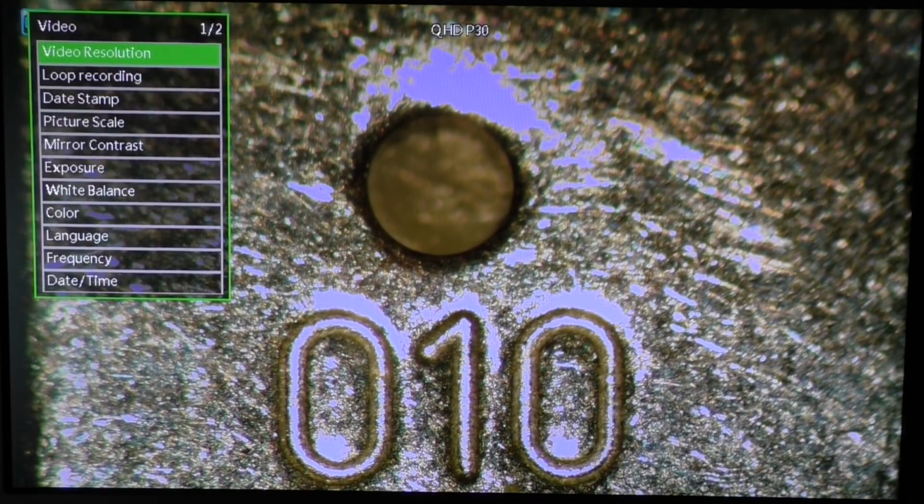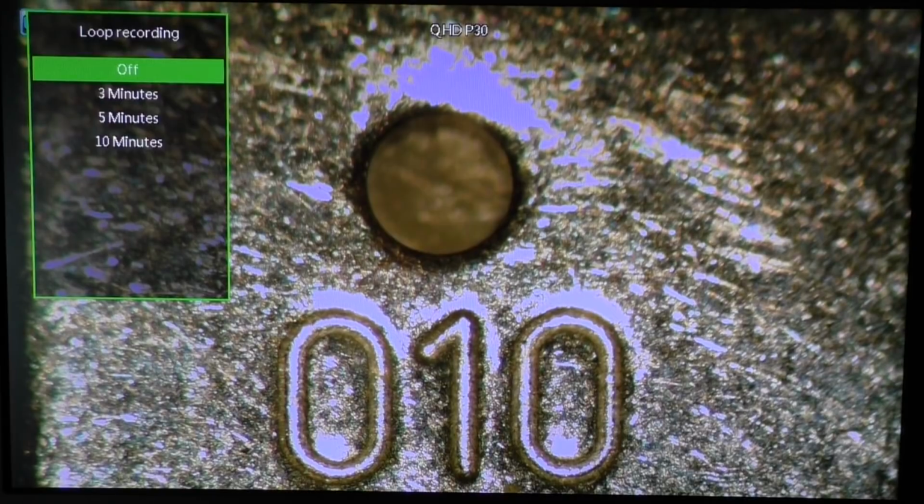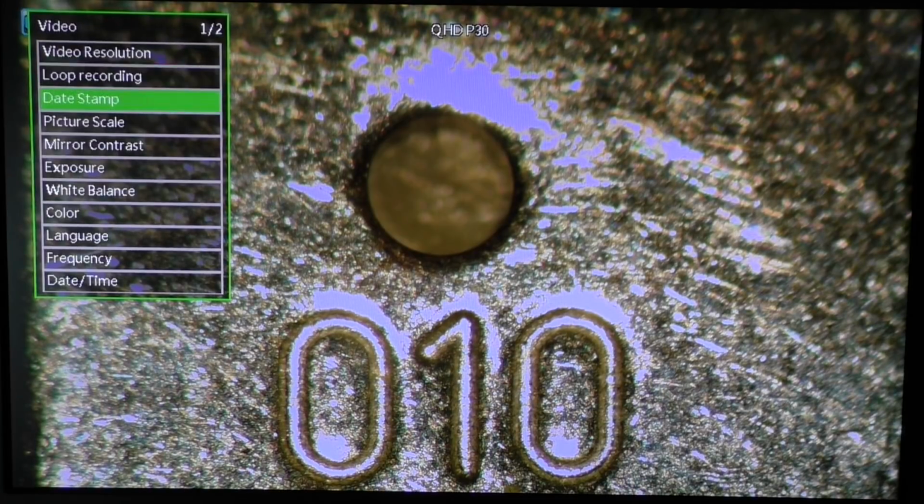Okay. Loop recording, that's interesting. That's probably something that comes from dash cams. So you can say off, 3 minutes, 5 minutes, 10 minutes. That means it will record 10 minutes and then starts to overwrite the oldest minutes with new minutes, and you always have 10 minutes. I don't know where you need that on a microscope camera, but it has it.